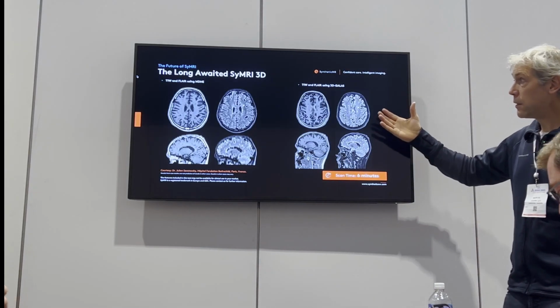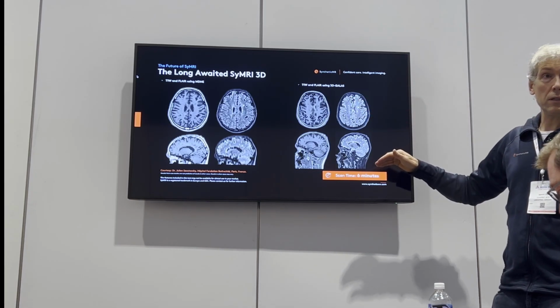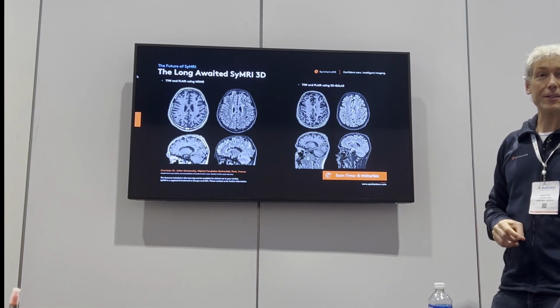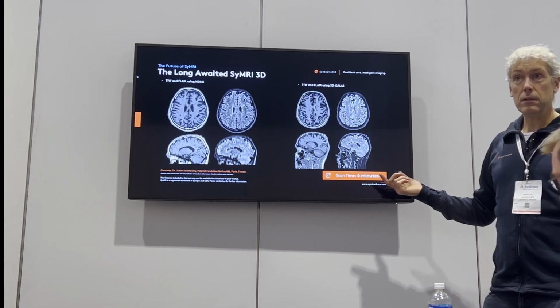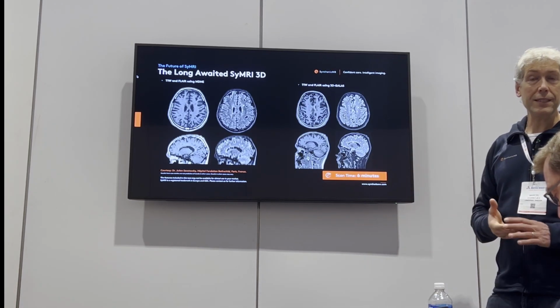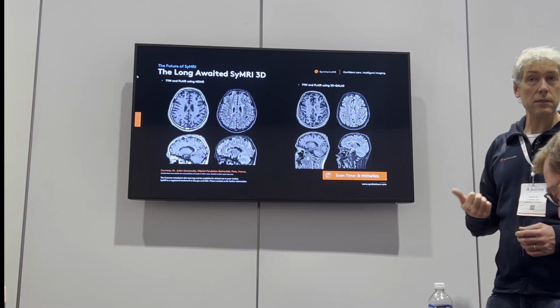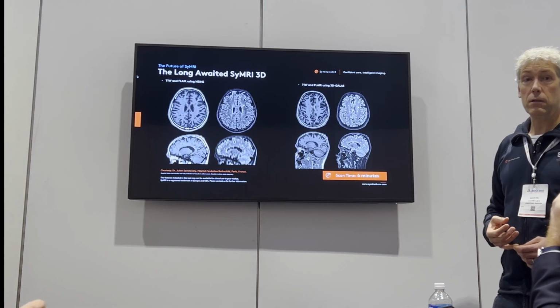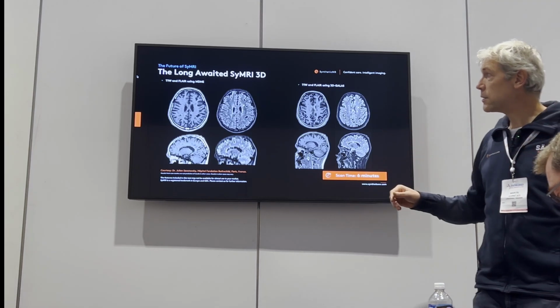Enter our 3D, a little lower resolution in plane, but now a much higher resolution out of plane. So typically we have 150 slices there. And the scan time is the same. So originally it was about 6-7 minutes, but with the advent of the AI recon methods such as AIR and SmartSpeed, we can go down to about 4 minutes now. 4 minutes, full quantification.